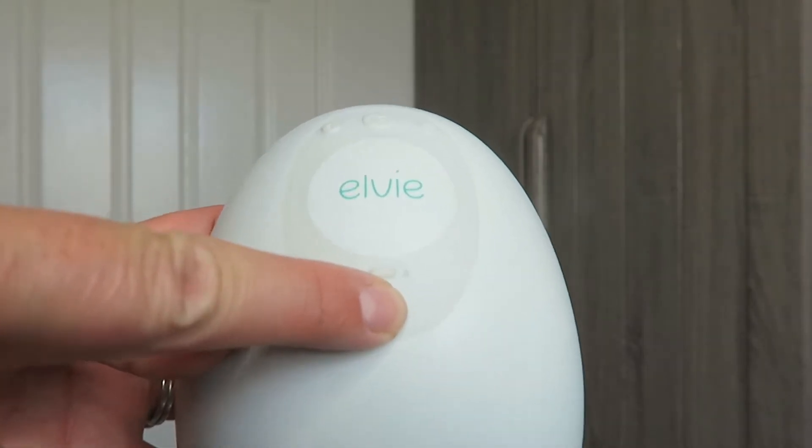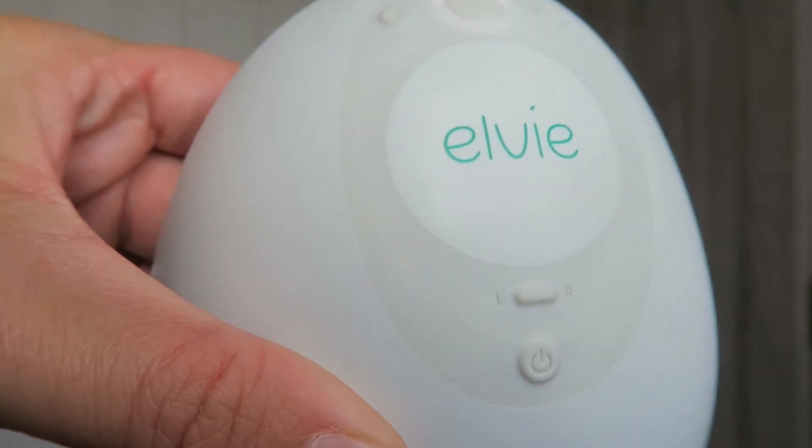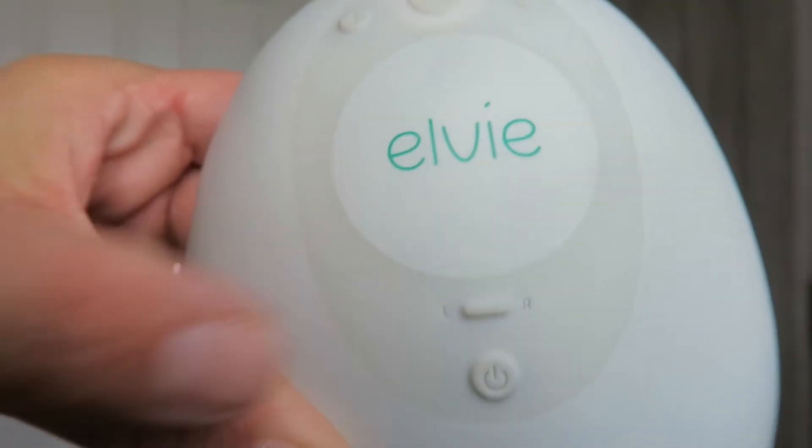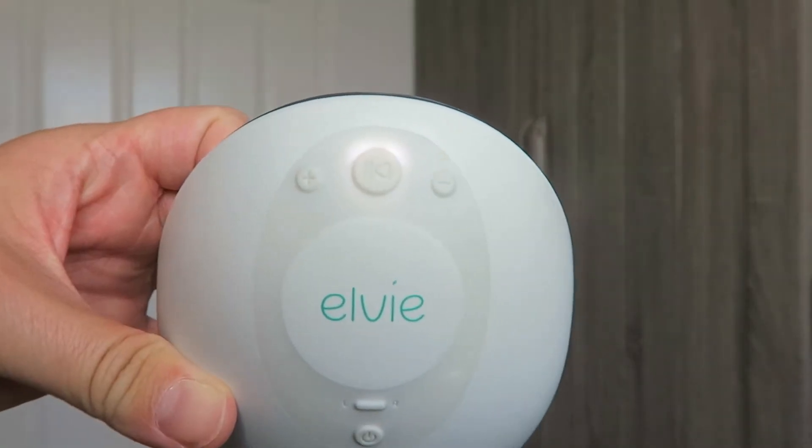The basic function is actually really, really easy. It does have an app, which I'm kind of 50-50 about, but for basic function without the app, we're going to turn it on here. So just one button — you press it, you turn it on, and then it lights up. There's a little indicator light here that tells me I'm on the left side. I can switch it to the right side, and then there's a little play button at the top. If you don't have the app working, it doesn't really matter left or right, because you can control everything from here anyway.